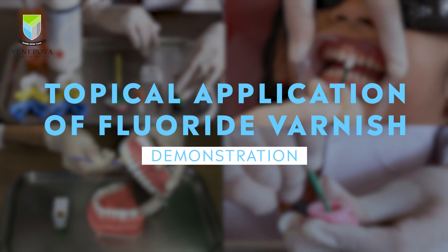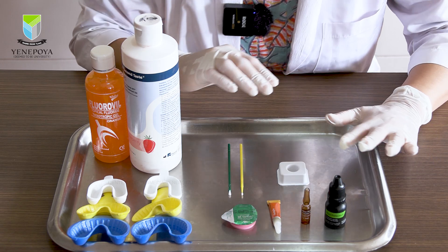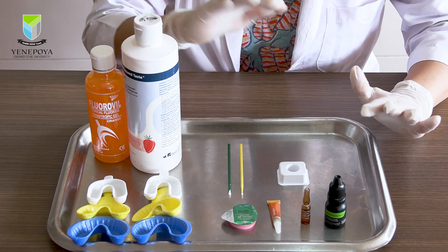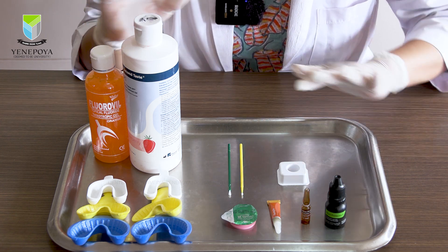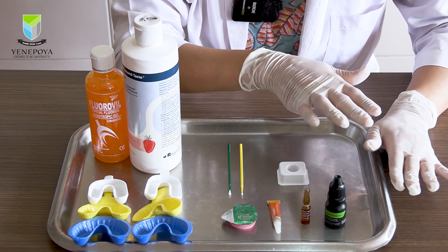This video demonstration is about topical application of fluoride varnish. On my tray I have displayed various topical fluoride options available in the department. I have a few varnishes on display and here are the two fluoride gels.